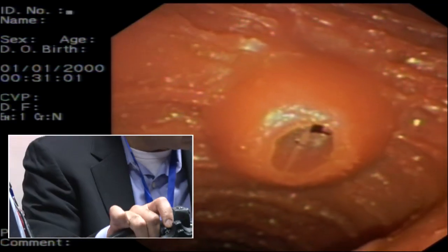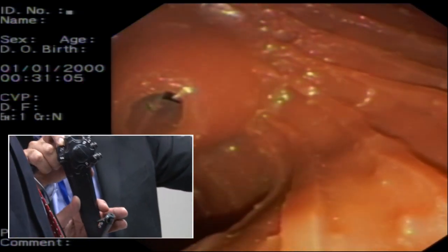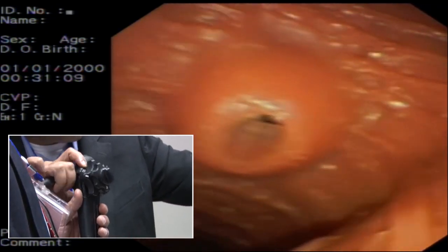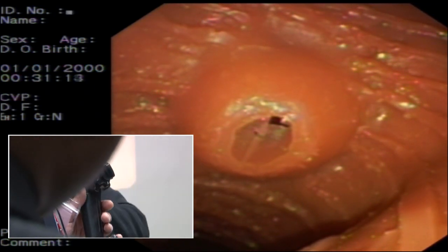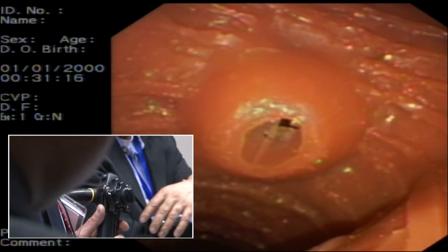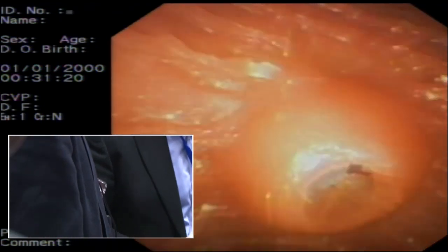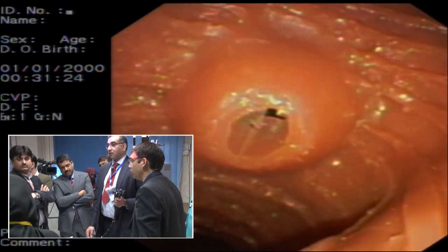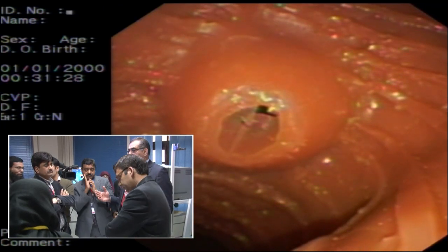If you are very close, nothing is happening. When the scope is straight and you are far, see how things get transmitted. For sure, people like me, away from the patient, and your scope very straight. And have a perfect height, a comfortable height for you. You're going to do a lot of these procedures, and you're going to have a lot of strain on your body.